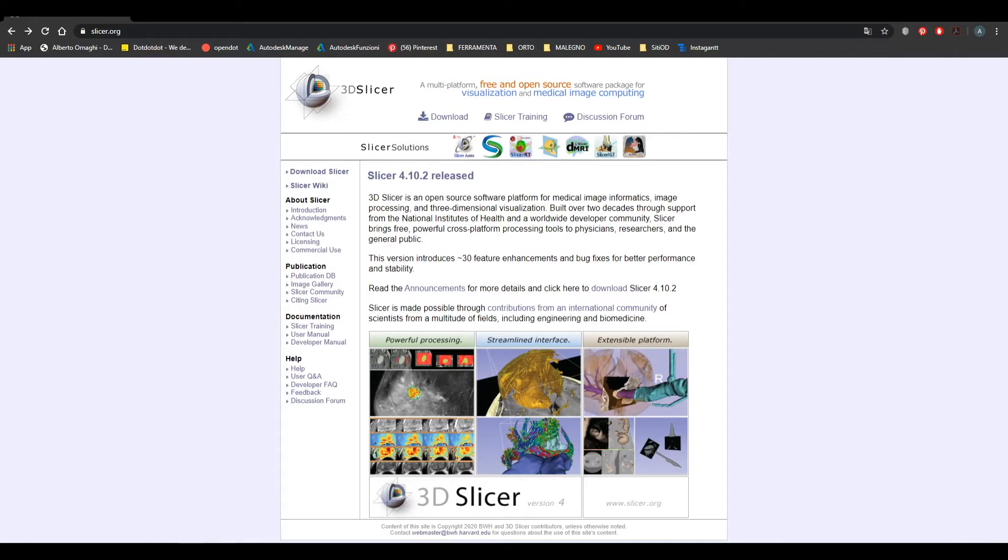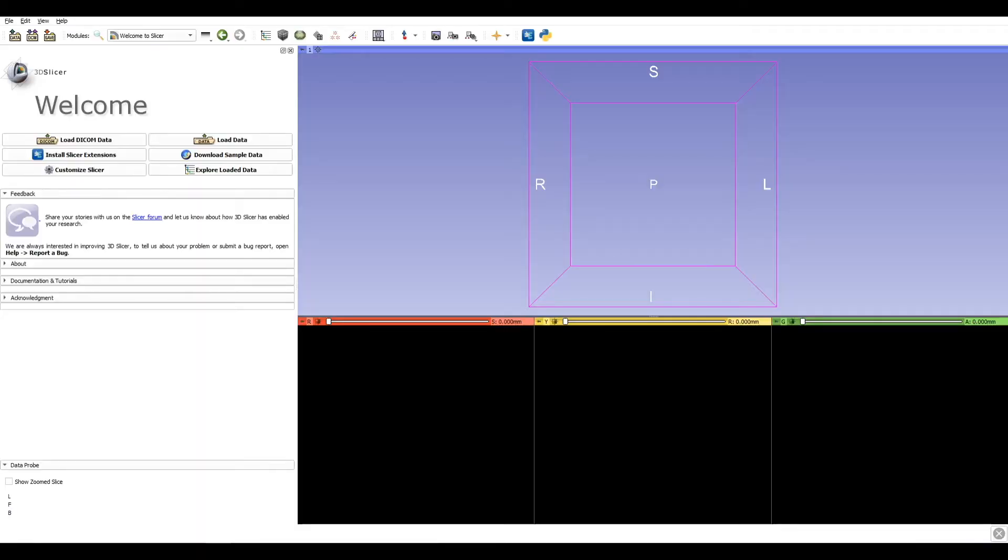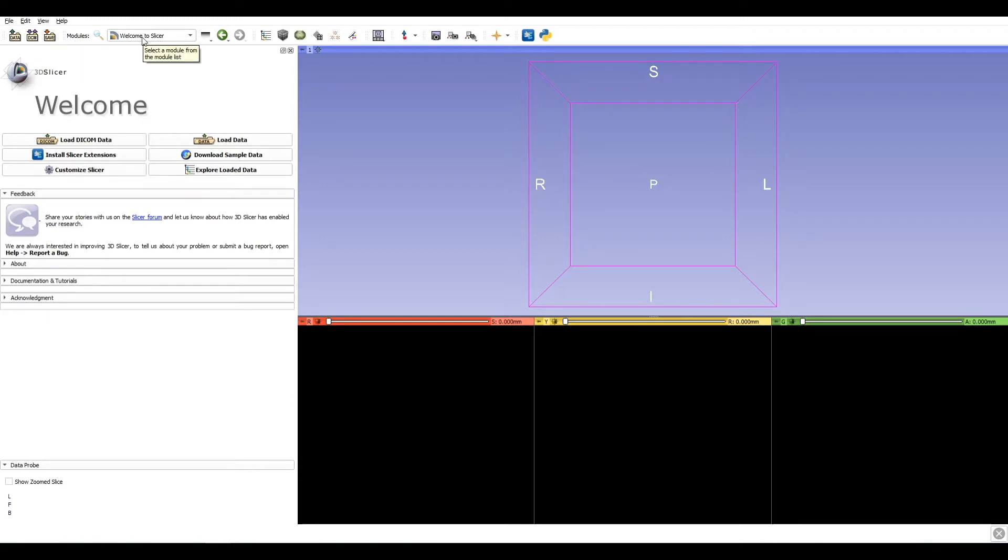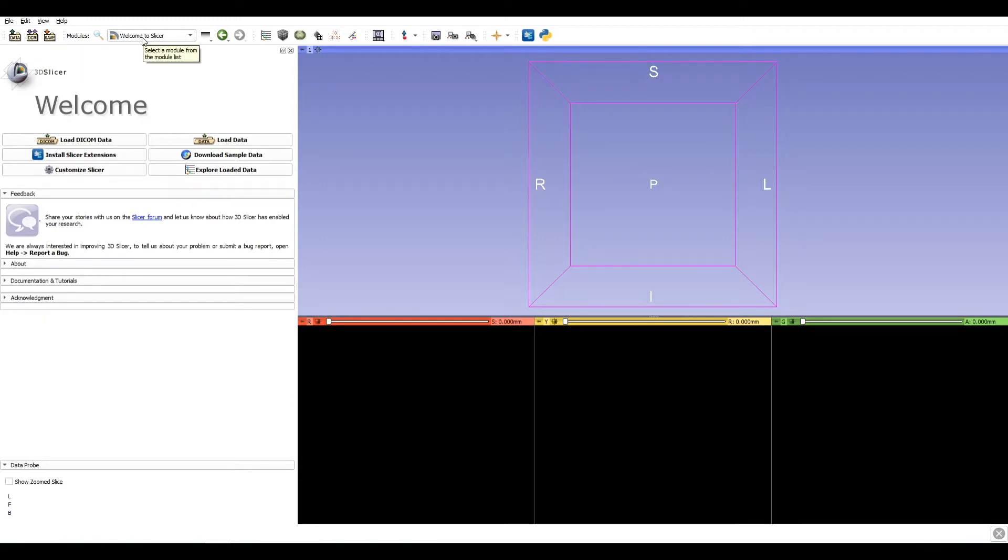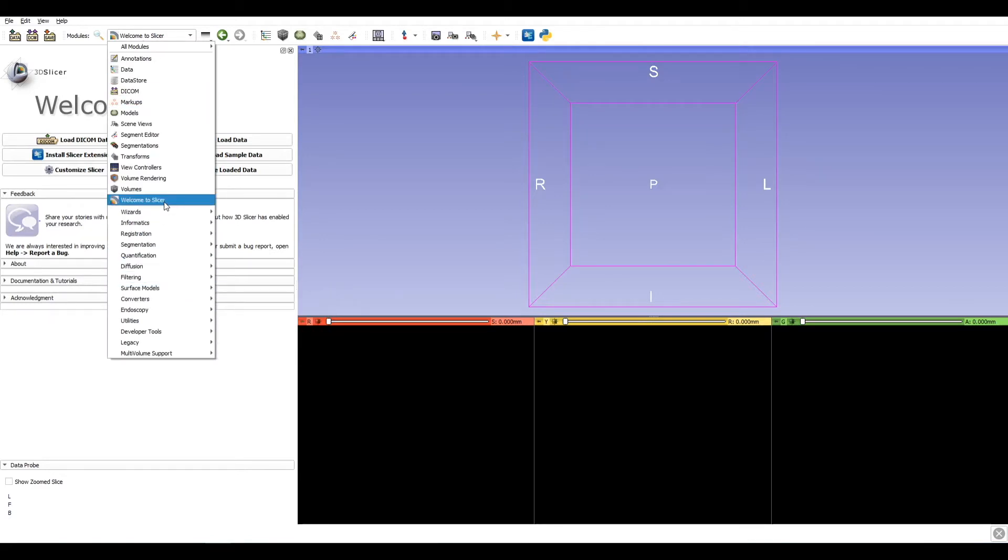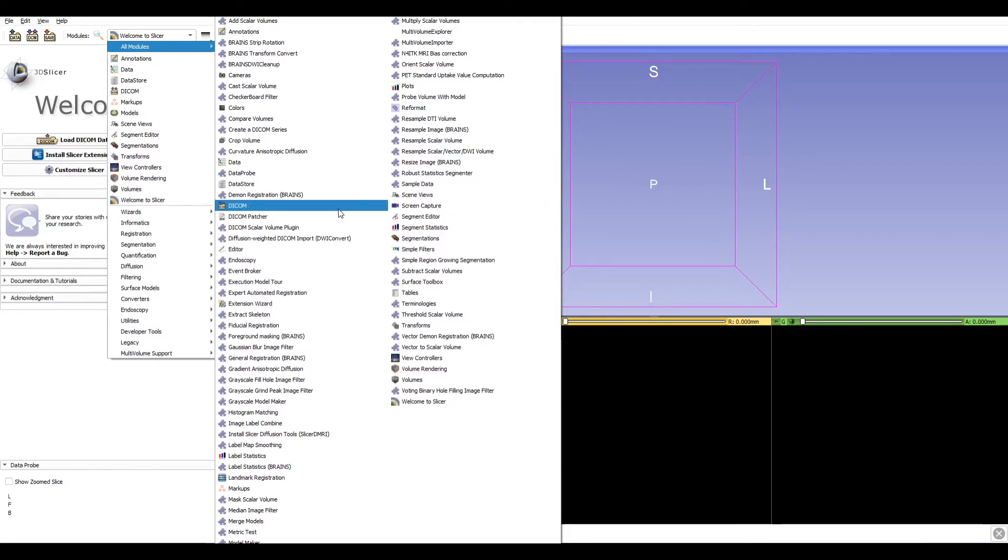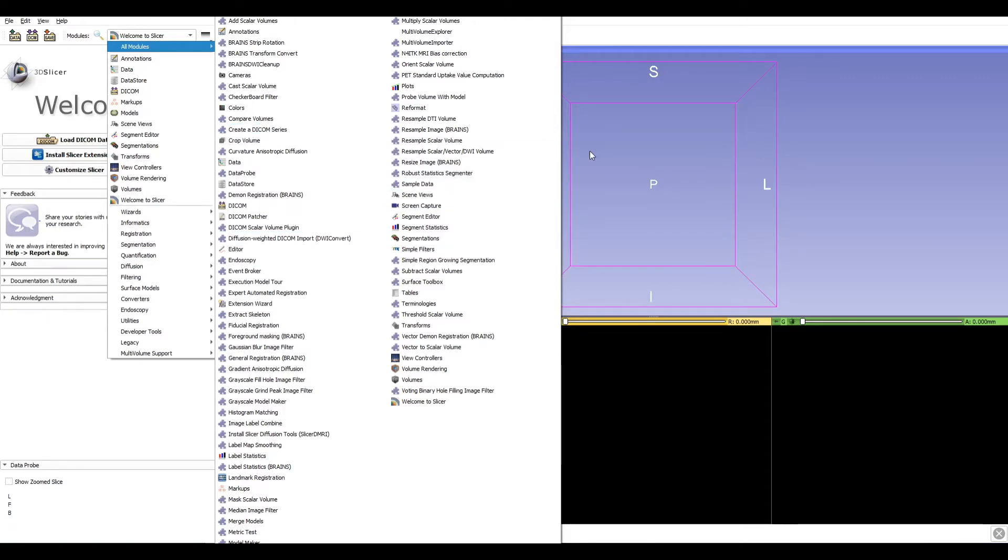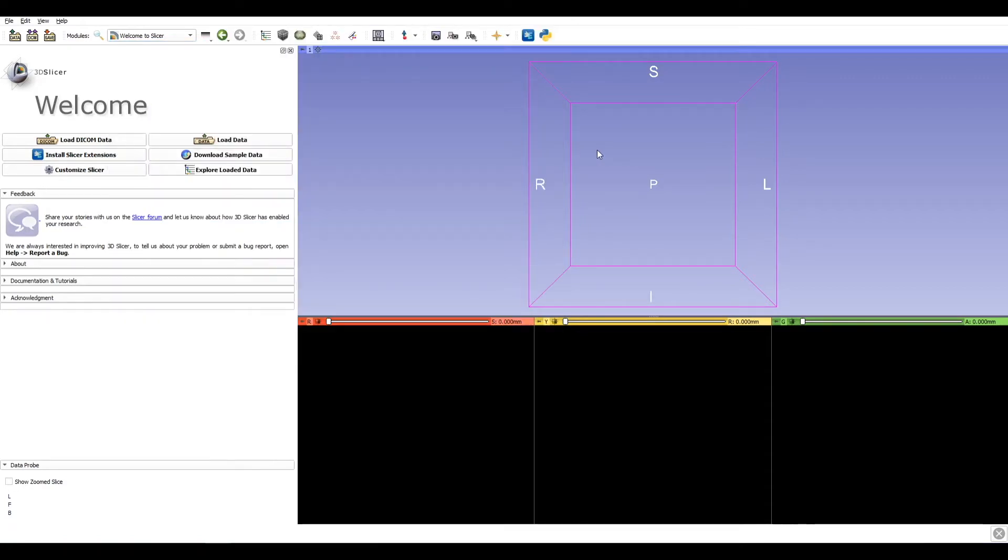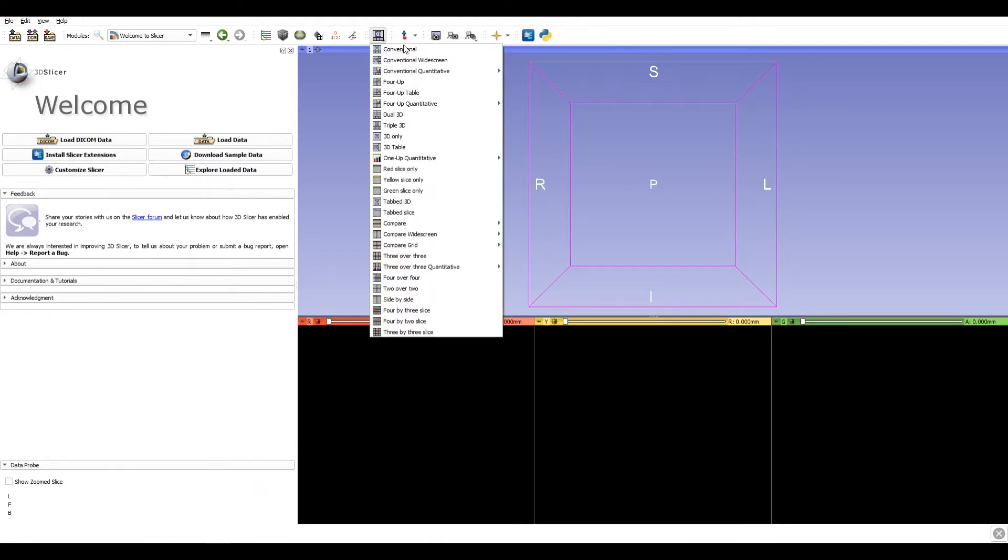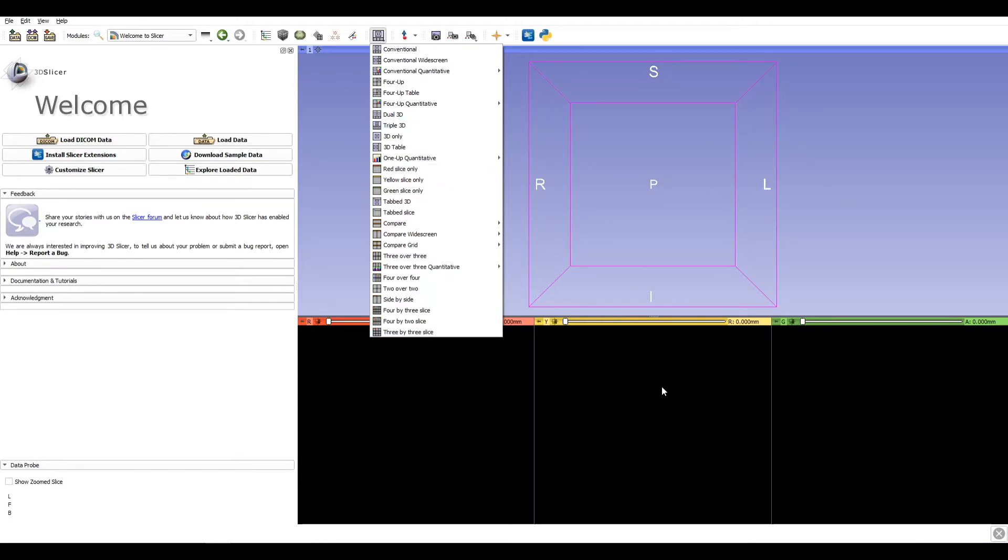Let's take a quick look at the user interface, which can be divided into three areas. Here on the top we find the toolbar where we can load, import, and save data. The dropdown menu shows us all the functions of the software that are called modules. Another important button is the layout, where we can choose which layout to adopt in the windows below.